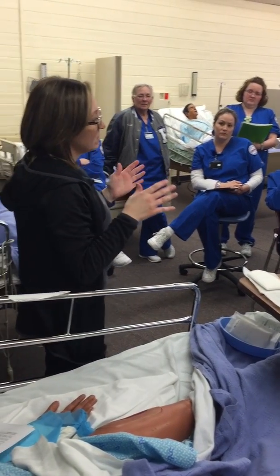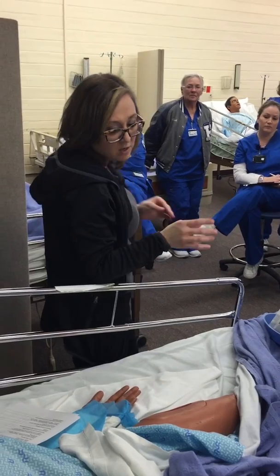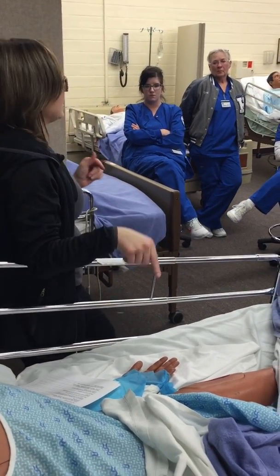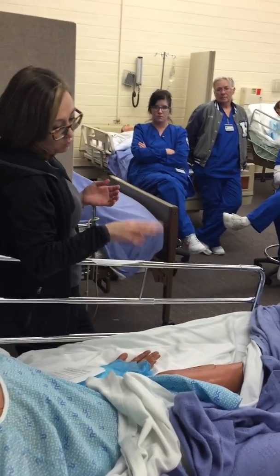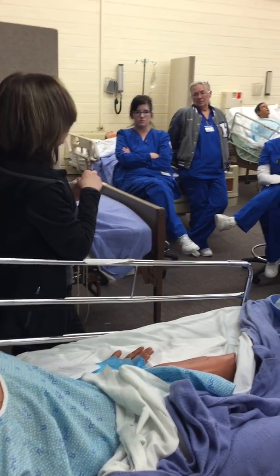Any questions so far? No? So I took off his dressing. Now I can actually assess the wound, yes? So what do you want to note about this wound when we're looking at it?